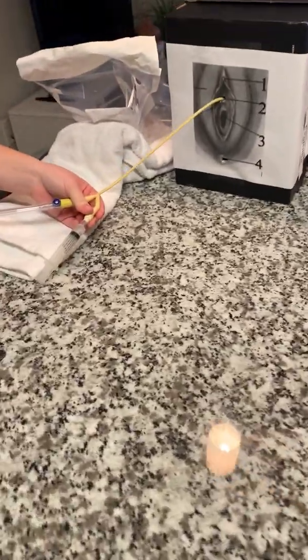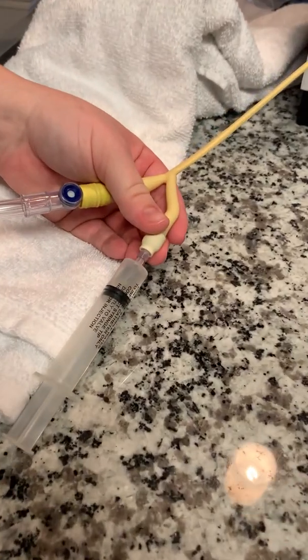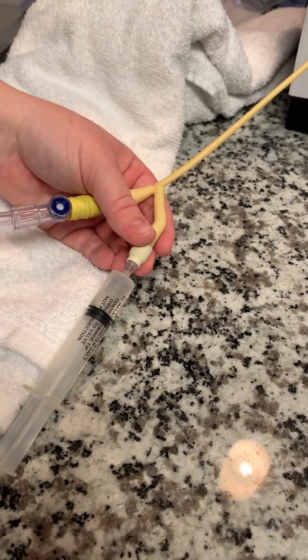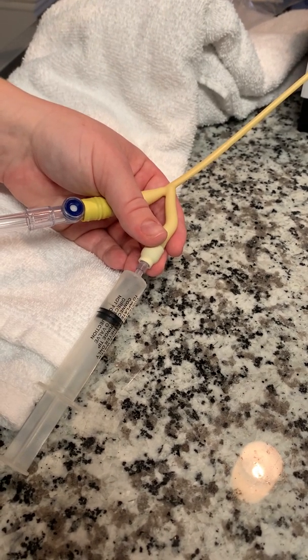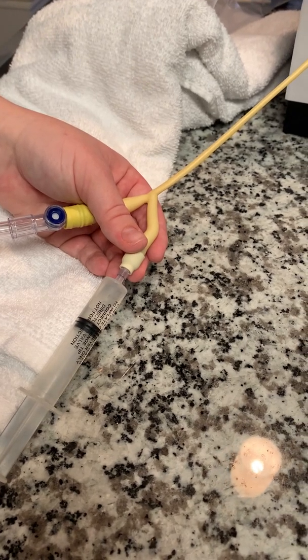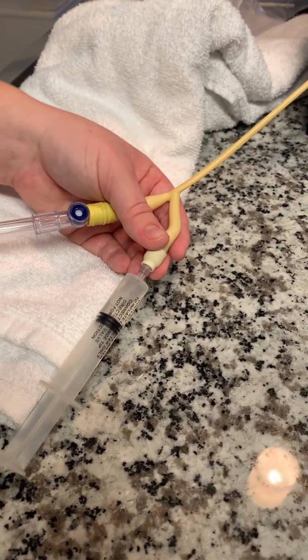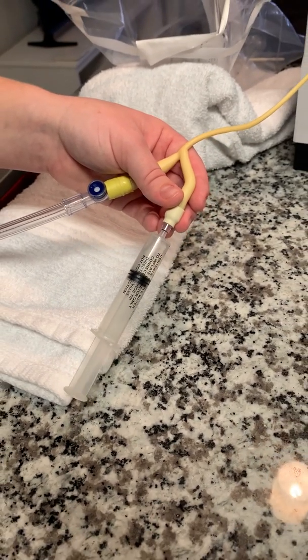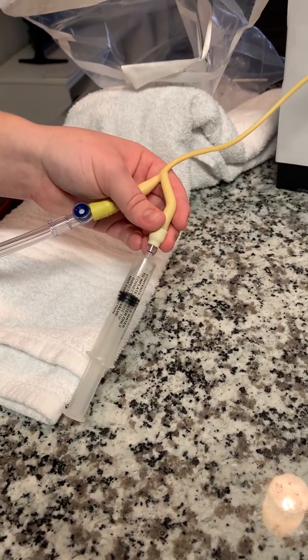And I'm going to let gravity do all the work. I want to make sure it's all removed before I remove the catheter because that could really cause harm to the patient.